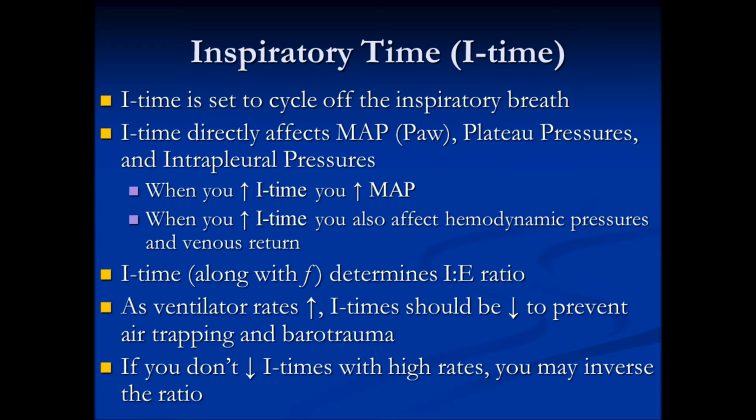Because if you have a rate of 20, then your total cycle time is 3, right? If you have your I time, just throwing out crazy numbers here, if you have your I time set at 2.5 seconds, that means you only have 0.5 seconds to spend on expiration.